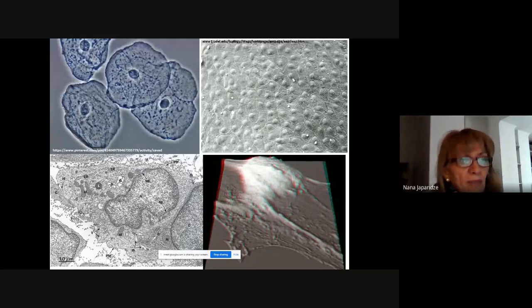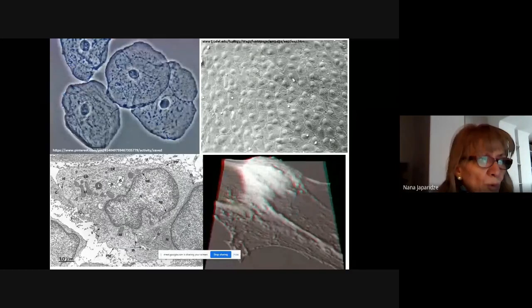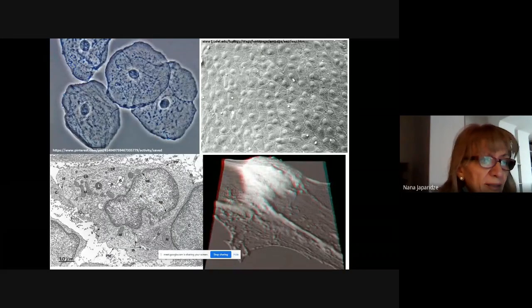But guys, the zoom here is quite low. I will show you this image with quite high zooming, and in that case you will see more details.